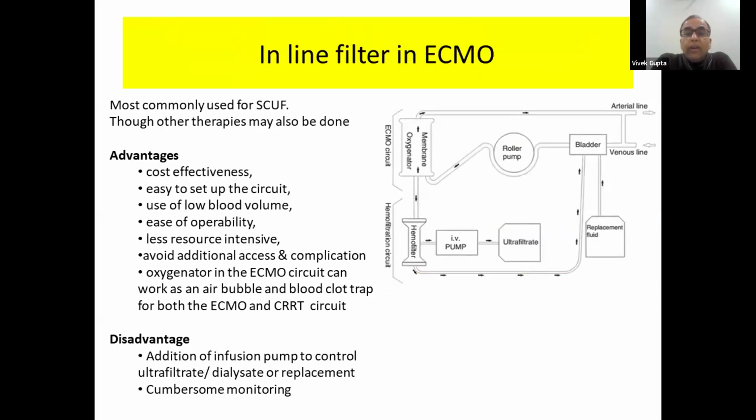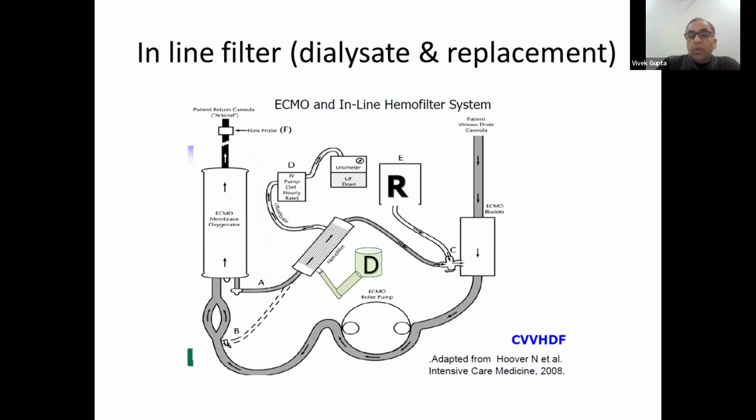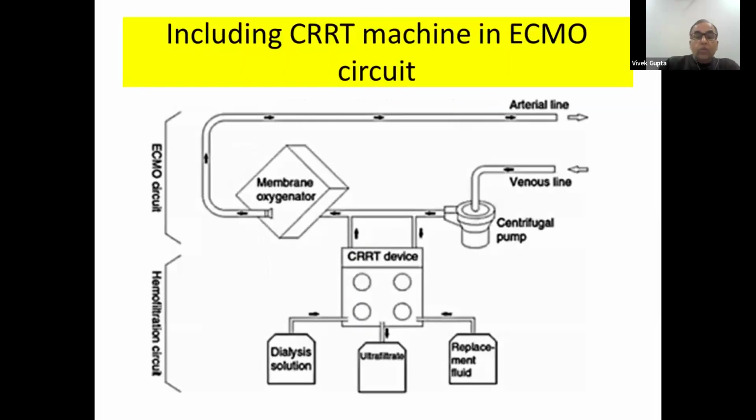Inline filter during the ECMO, it is cost effective because you are just putting a filter. Usually with the filter only you can take out the fluid. But when you add dialysate to it, you can convert the therapy to a CVVHD, and when you add the replacement fluid, you convert the therapy to the CVVHDF. But only issue is these replacement and dialysate fluid has to be administered with the use of an infusion pump, which can be an issue because their accuracy definitely is going to be compromised.